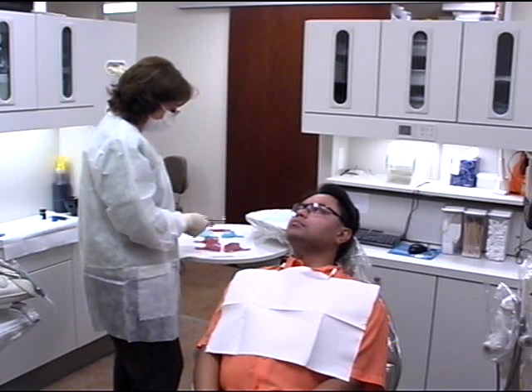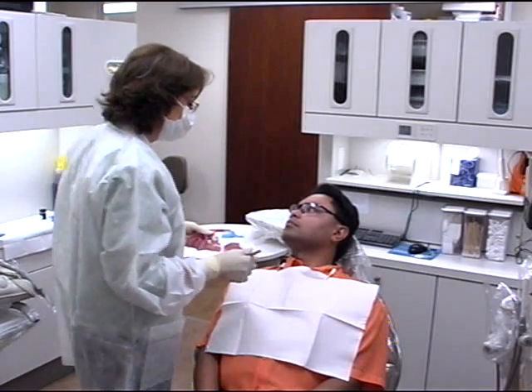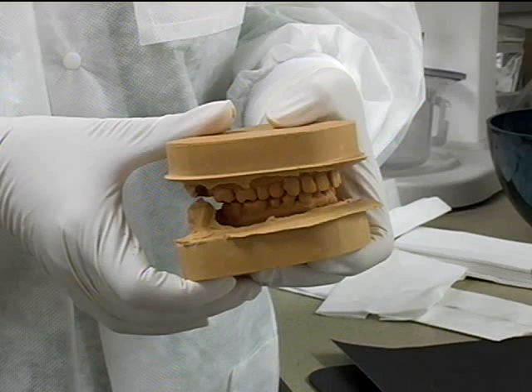Impressions can be made of several teeth, a quadrant of the mouth, or a full arch. They can be used as diagnostic models for patient education or for the fabrication of custom trays for home bleaching. This demonstration will concentrate on making an accurate alginate impression.